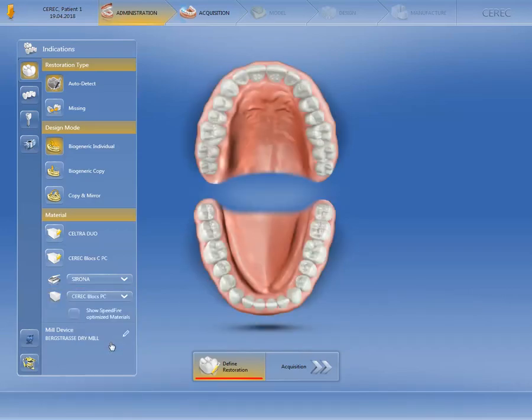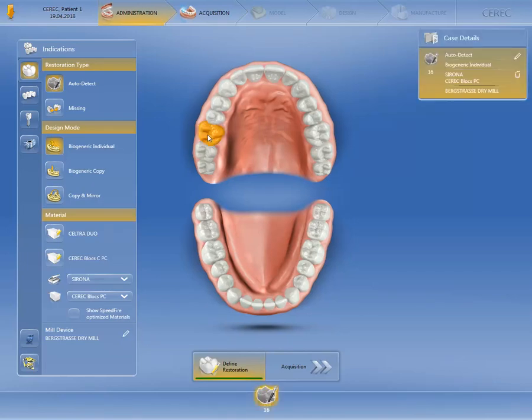Only once we've defined or activated all details in the indication window, we can determine the position of the restoration in the odontogram. All information for this restoration is shown in the window under Case Details, and we can switch to the next phase, the Acquisition Phase, by clicking on the double arrow.